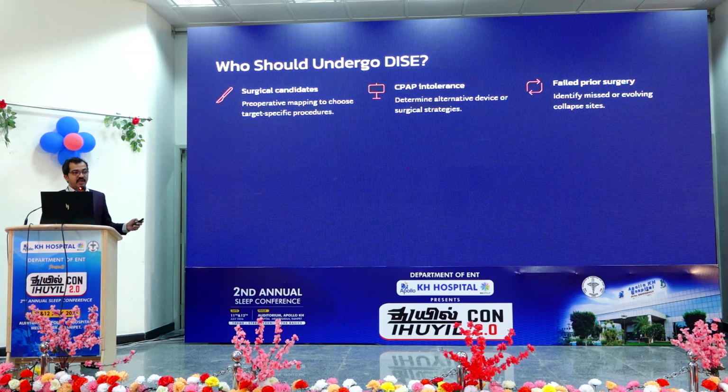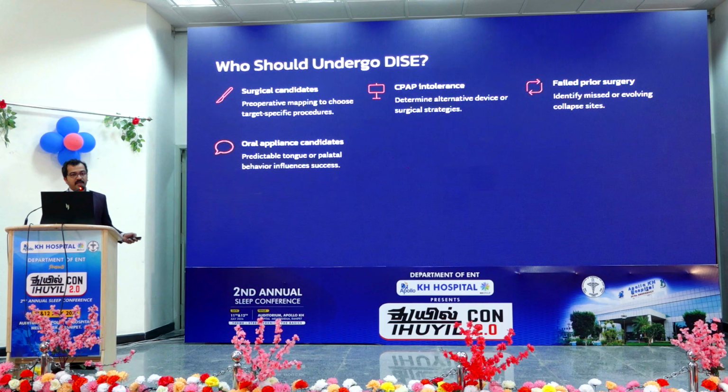DISE. Failed prior surgery. Morning sir has had a wonderful session on surgery failures. So all patients who are going for a second surgery should have a DISE done prior to the second surgery. In patients who are candidates for oral appliances, you can do a DISE, and at the same time you can do a mandibular advancement device titration with special gauges, which helps to predict the success of mandibular advancement devices.